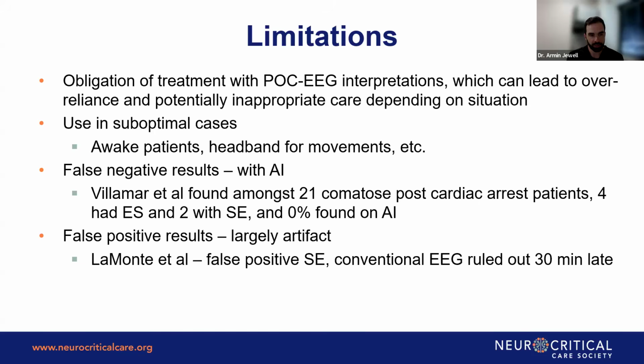Then there are false negative results with the AI. In one study, for example, in cardiac arrest patients, there were some that had status epilepticus that wasn't picked up by the AI. So again, just knowing the limitations of AI is important.